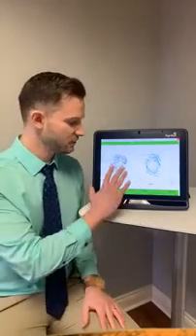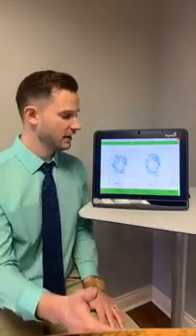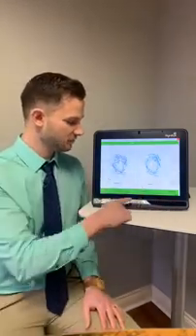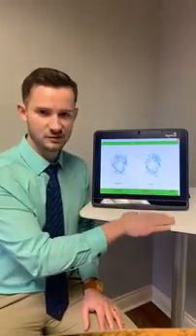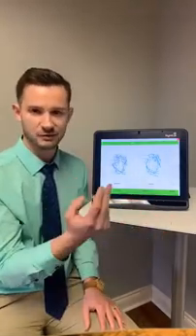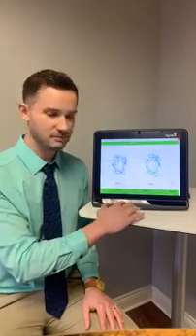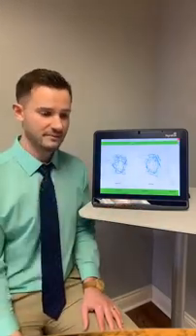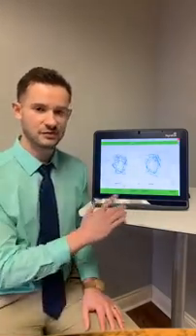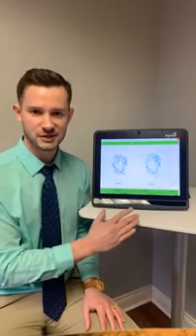The test, the patient actually sits right in front of it and the panel right here has sensors that can see where the patient's eyes are at. Our eyes give a reflection and the panel picks up those reflections. And then the test goes through various different eye movements that the patient needs to do.